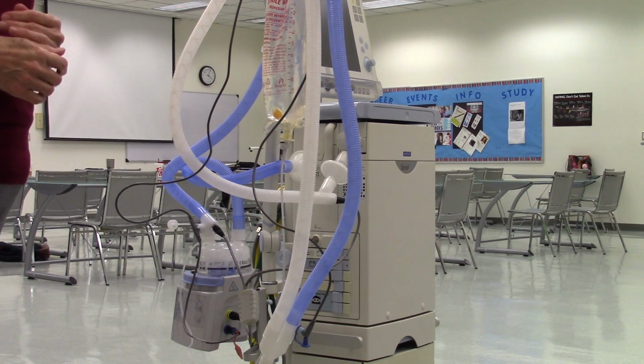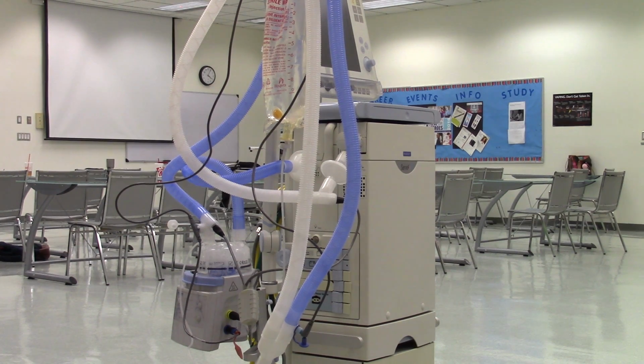Yes. Okay, understood. Some hospitals use ventilator circuits that are not heated. In this case, the gas will cool as it travels to the patient. What will you need to place in the circuit to collect the rain out water that collects? And the answer to that is a water trap meant for ventilator circuits. Oh, like the little bag, yeah. But instead of it being a bag, it's a cup that's rigid. Okay, a rigid cup. Yeah.